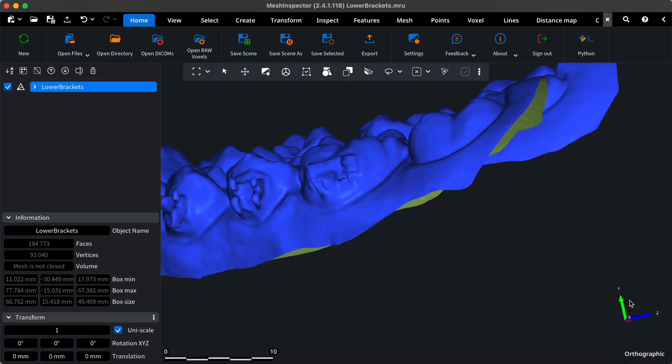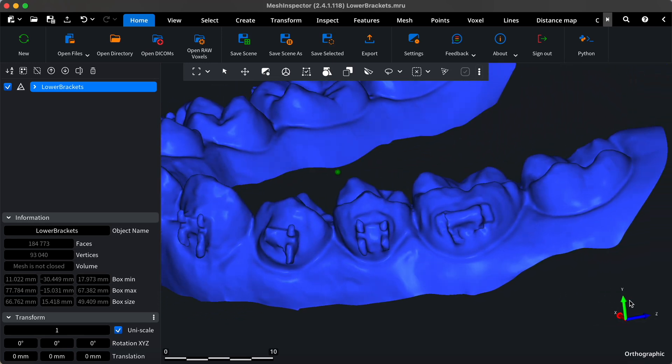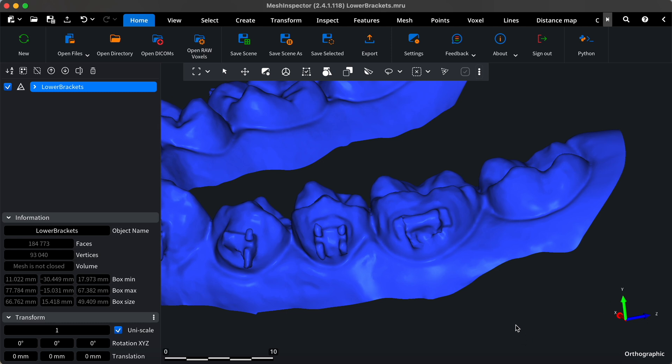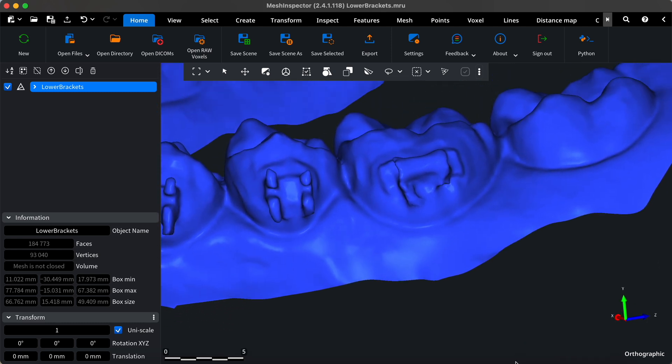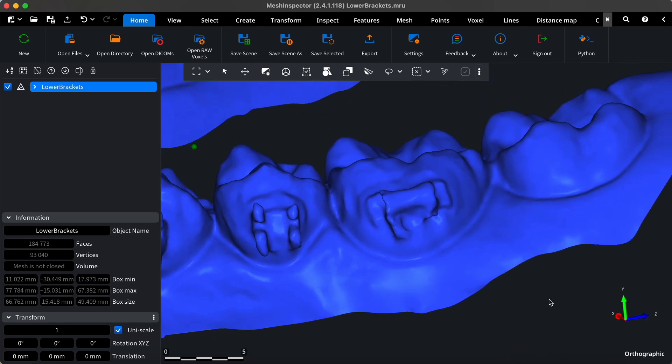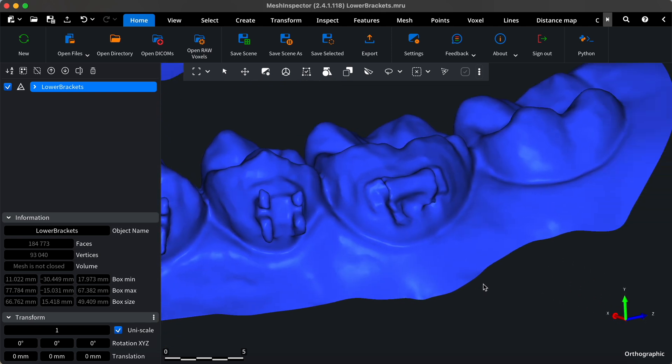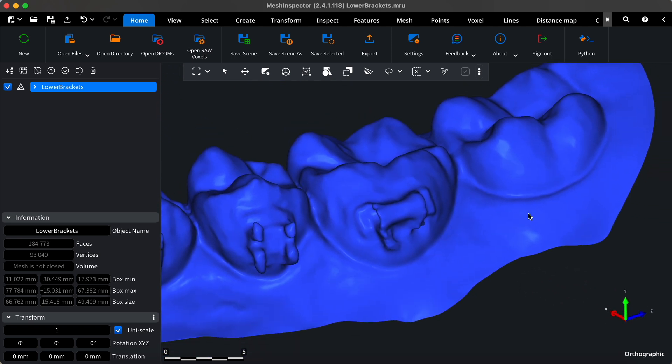In this video, we'll demonstrate how to remove brackets from a dental mesh scan, a crucial step for dental technicians. Removing brackets from 3D mesh scans is essential in dental labs to ensure accurate models and precise dental appliances like crowns or aligners. Let's get started.